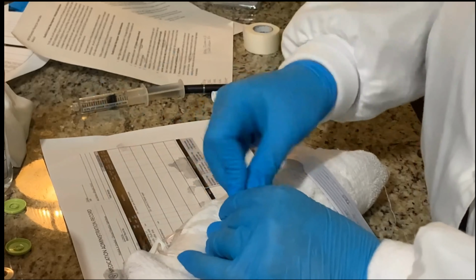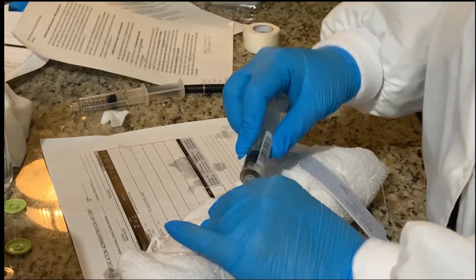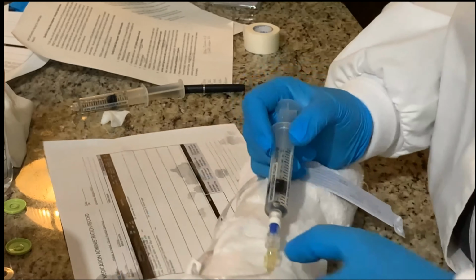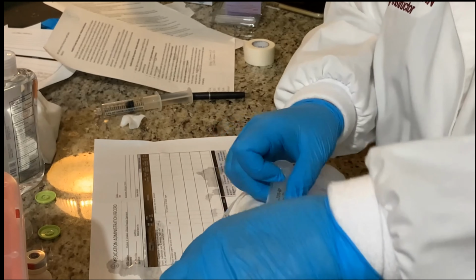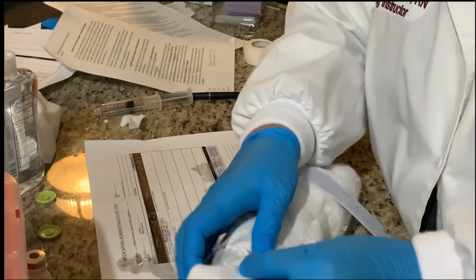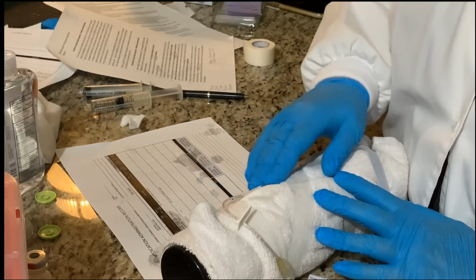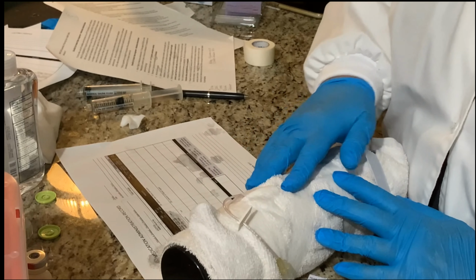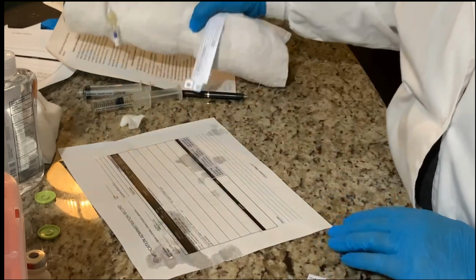Now for this one, this time, I actually pulled out and put it down to 3 mLs. Attach your saline, and you're just going to give this slowly. And then once you finish, you're going to clamp it off, and then remove your syringe. And you're going to assess your IV site. Is it edematous? Is it red? Is it draining? And ask Millie, how does it feel? Feels fine. So now I'm going to document all that.